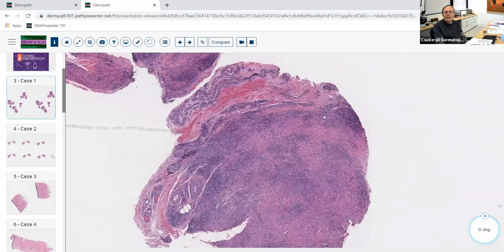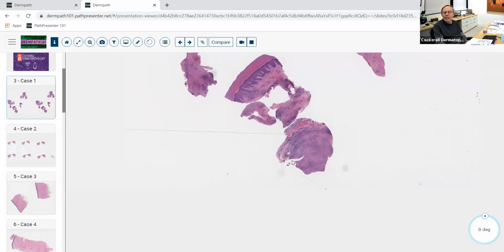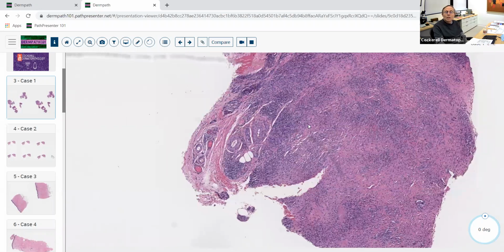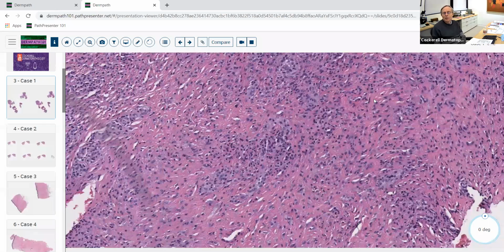And you can see how deep this is. Notice that we've got the papillary dermis here, the reticular dermis. This lesion is situated down in the lower part of the reticular dermis and maybe even impinging into the subcutaneous fat. So nice example. Again, the differential diagnosis would include subcutaneous GA. We call it subcutaneous GA when it's really in the lower reticular dermis, but basically palisade, fibrin, maybe some degenerated collagen, usually not much mucin in a rheumatoid nodule.